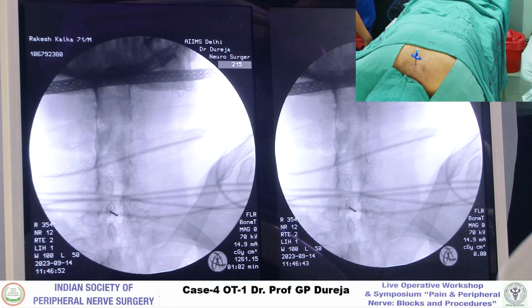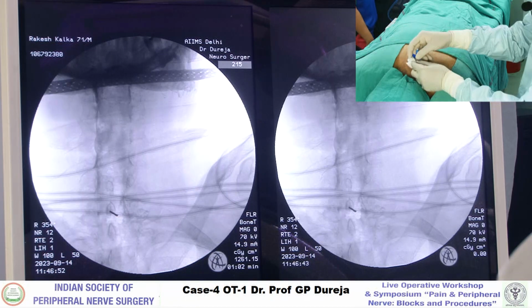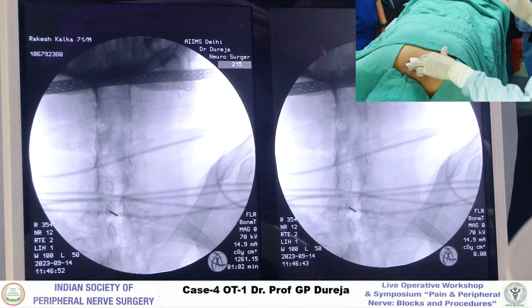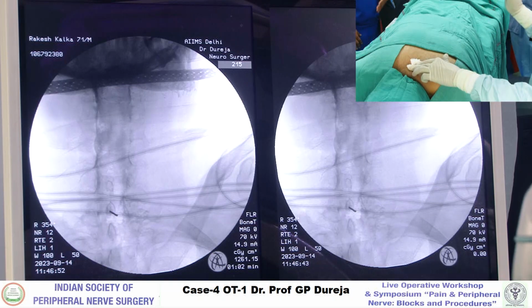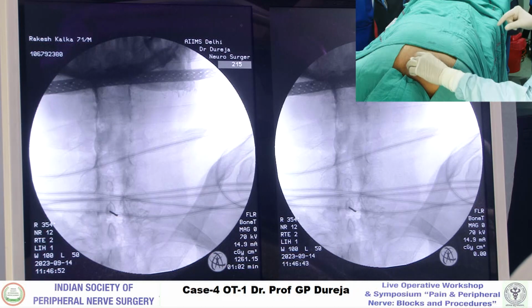Is this entry point the standard for all cervical epidurals? No, you can tailor it up or down, but the favorite sites, the easiest sites, are C7-T1. You can go C6, C7 also. Sometimes C4, 5. But it's easier to identify C7, the prominent spinous process, and the interlaminar space is quite big. In the upper segment, this is very narrow. Yes, sir.